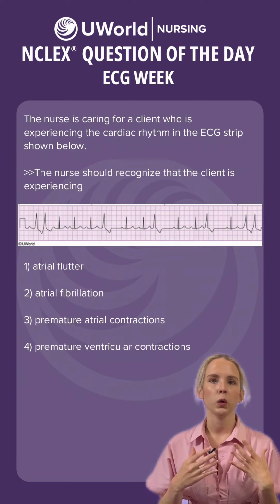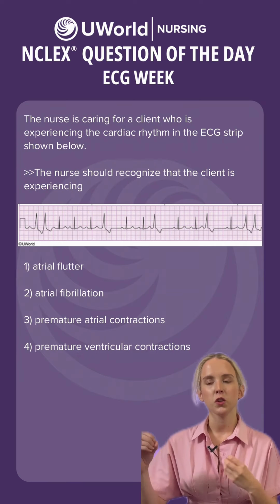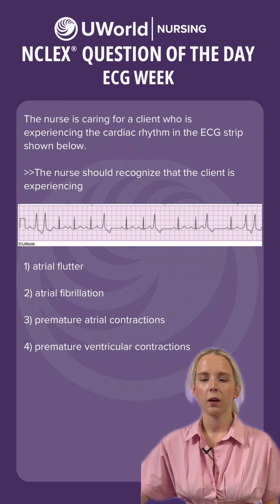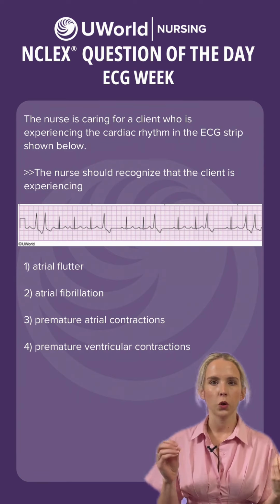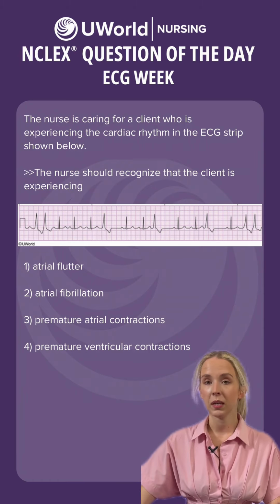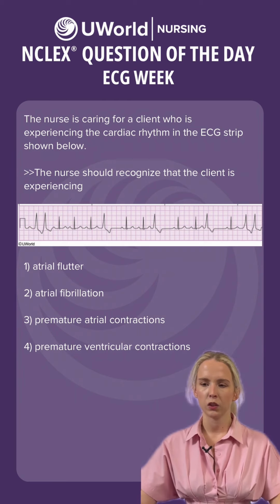We'll also have an irregular rhythm, which means that the transition from the atrial electrical activity on the ECG to the ventricular electrical activity on the ECG will not be smooth. This irregular rhythm will look like a hidden P wave within the QRS complex. Essentially, an out-of-sync jolt in our ventricle is going to hide that P wave. So since our P wave is hidden, we're not going to have a measurable PR interval, and the QRS is going to be wide and distorted.